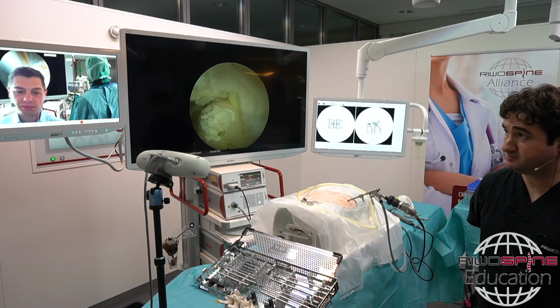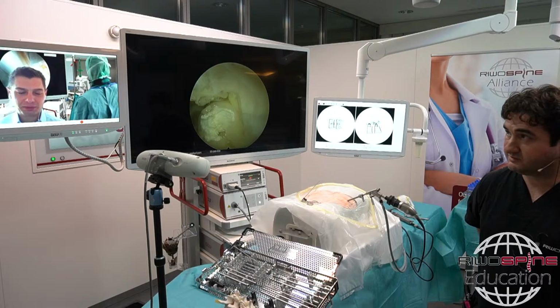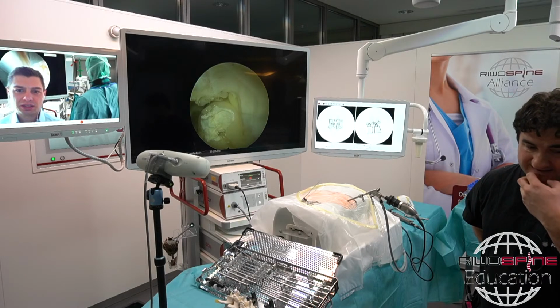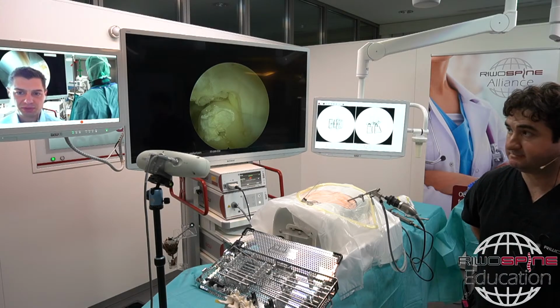We had, of course, a lot of bleeding, and we did not see anything at all. And the problem is at that step, we were not sure what is inside the whole blood. So if there's any neurostructure, with the normal bipolar, we would have injured them. So we could not continue the surgery because it was too dangerous. And from that moment on, he said never again he will do it that way. So the 4 megahertz radio frequency is pretty much mandatory.